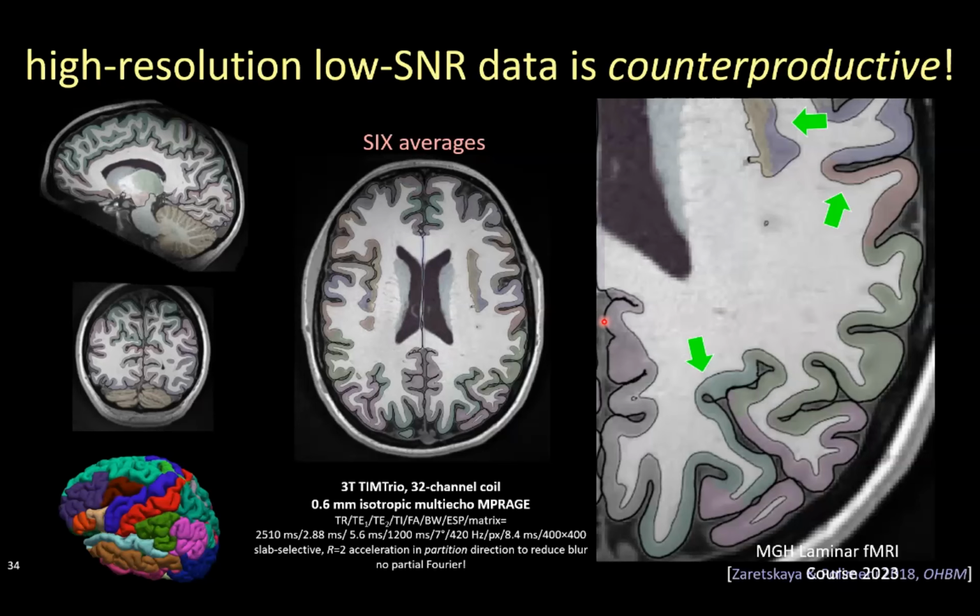On the one hand, it's the bread and butter of what an MRI scanner does. On the other hand, it's challenging to utilize it for our purposes. So put a little bit of effort into it, but once you have a good protocol, you can stick to it. You don't want to optimize for every new area of interest. Rather, you can put it together as a center or a team: this is our T1 protocol, and that's how we do it.